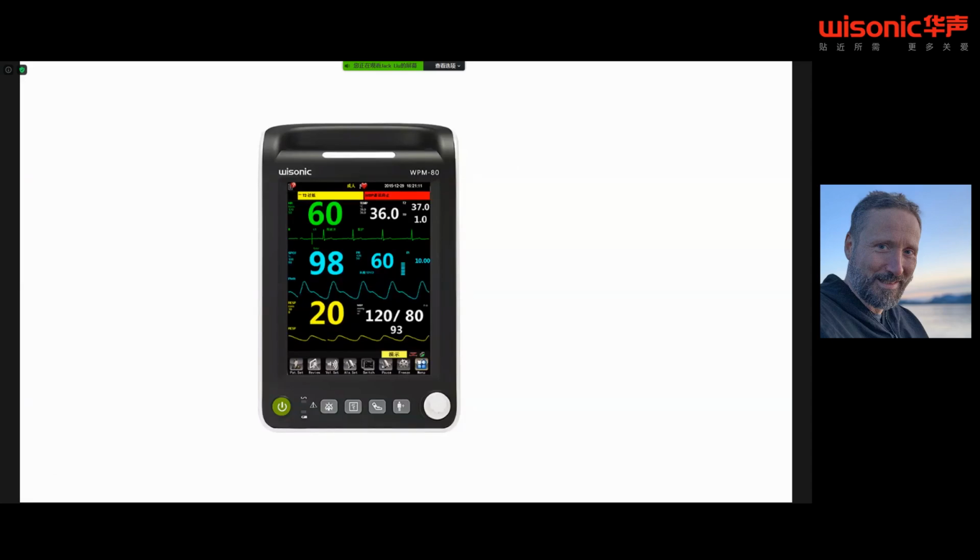When talking about safety, I would like to start with standard monitoring. I would expect that most of you would agree that we should provide an ECG, oxygenation measurement and blood pressure measurements before we start with a block procedure, and that our patient should have an IV cannula in case we need to provide IV medications due to some side effects or just for the matter of sedation during a block procedure.